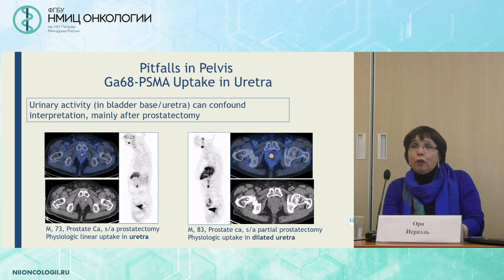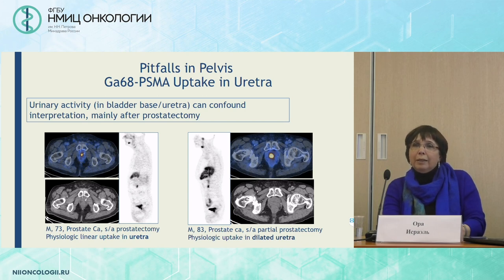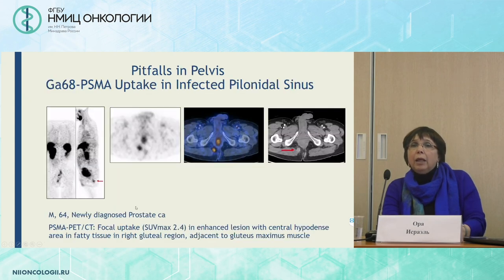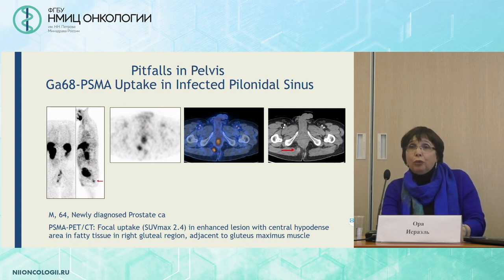There can be pitfalls when looking for primary prostate cancer recurrence in the pelvis, related to uptake in the urethra, which can be either focal and small or more enlarged when the urethra is dilated. There can also be uptake in other processes, like a pilonidal sinus — an infected one — that takes up PSMA in the proximity of the primary tumor in the prostate.